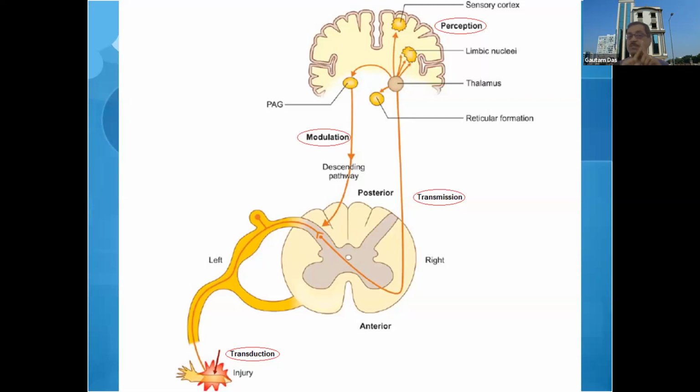Alternating current means it changes its direction from one to another. So when we are using an RF stimulator, what kind of current are we using, direct or alternating? Whenever I ask this question in classes, many answers are that it is direct current because we are using a cell. A cell delivers direct current, but your RF stimulator machine converts that direct current into alternating current.